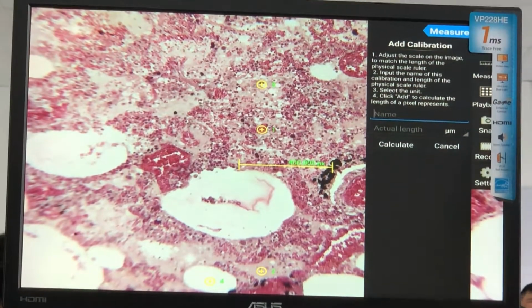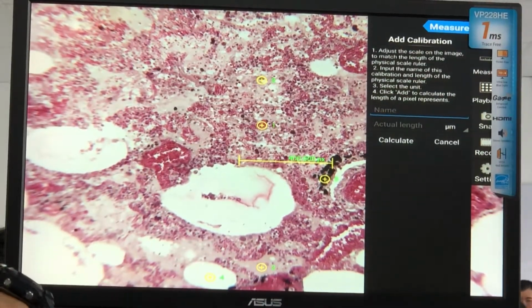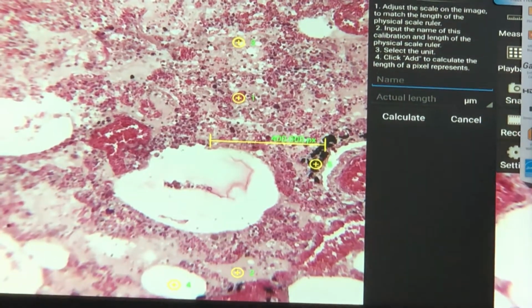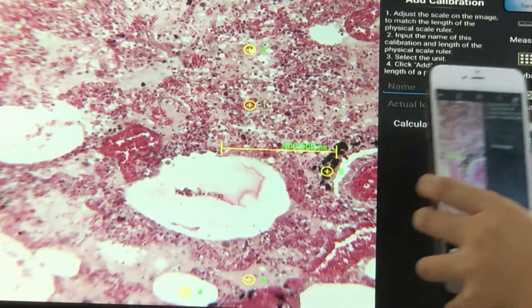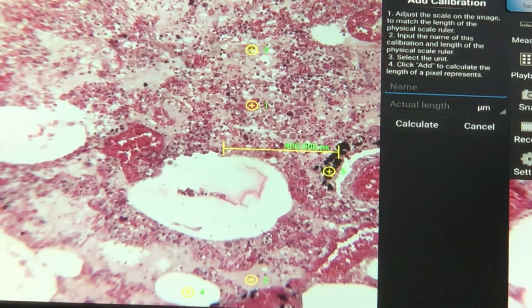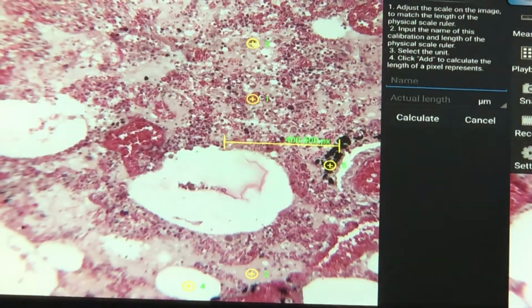And I'm going to challenge you, who can answer me? What's this? What's that? Number 5. Number 4, what's that? Yes, that's anthracotic pigment. So right now, you are already thinking about the practical exam. I just hope you will do well in the practical exam, that would make me very happy. Sometimes the grades are just average, so I just hope you stay relaxed.